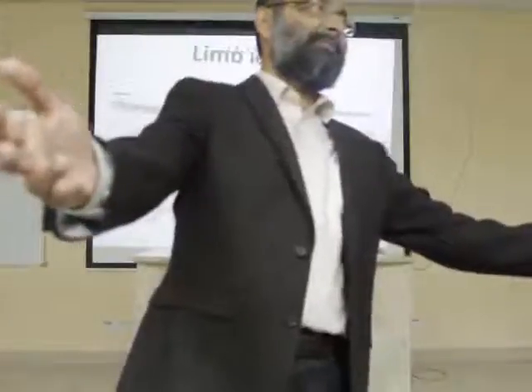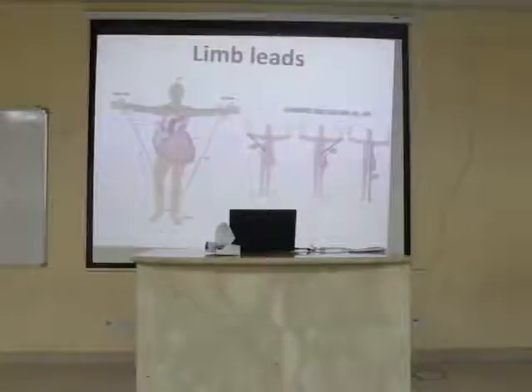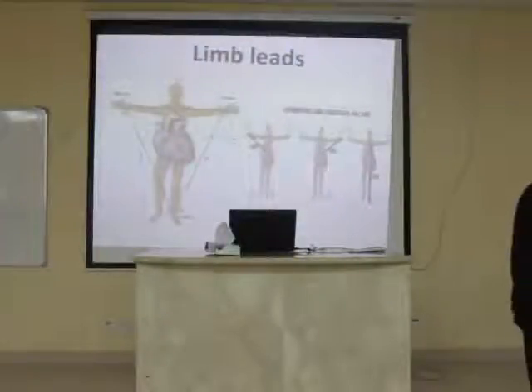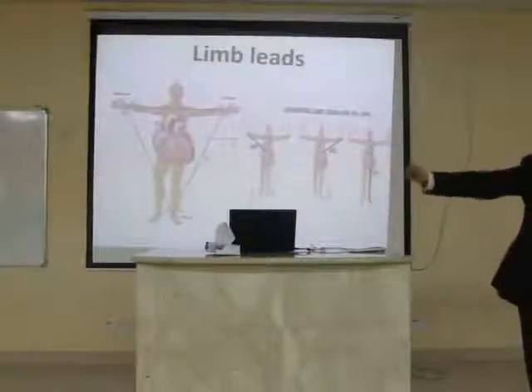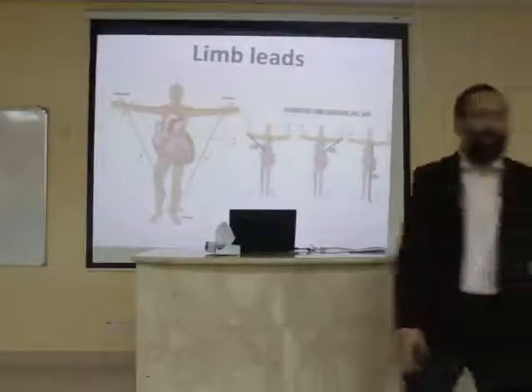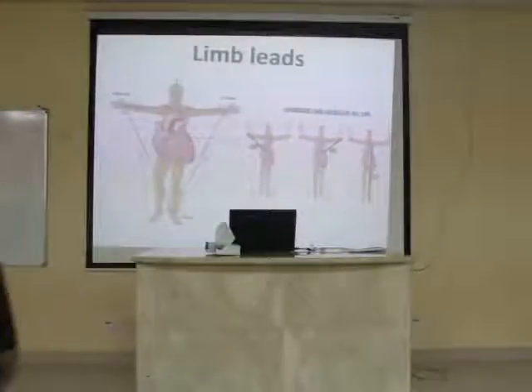Did we use the left? I'm saying the right one. Do we attach the electrode here? It is connected to the machine, that's okay, but that is for another purpose, for earth, for preventing fluctuations. In the ECG making, the lead systems, you don't use the right leg. What 3 limbs are used? Right arm, left arm, and left foot. Now this system is a positive negative system. Class, very quickly get the meaning.